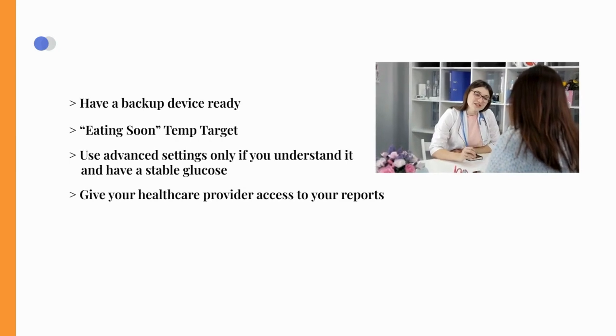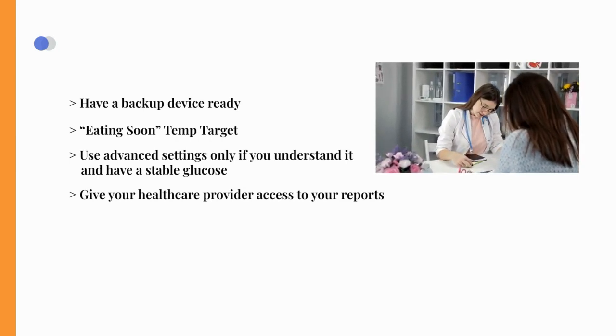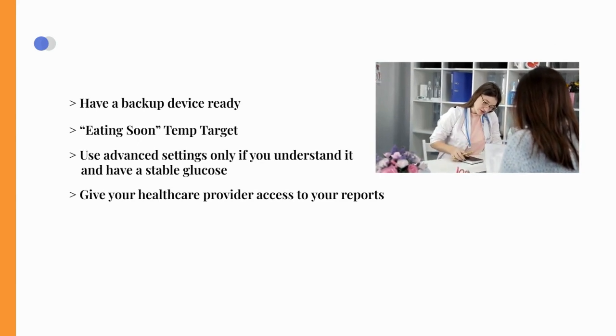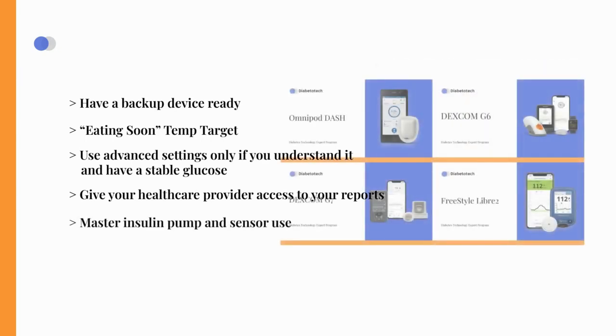Healthcare provider access. Ensure that your healthcare provider has access to your reports generated by NightScout. This enables them to stay informed about your diabetes management and make informed decisions during your medical consultations. Master insulin pump and sensor use. Make sure you are able to use your insulin pump and sensor properly as well.